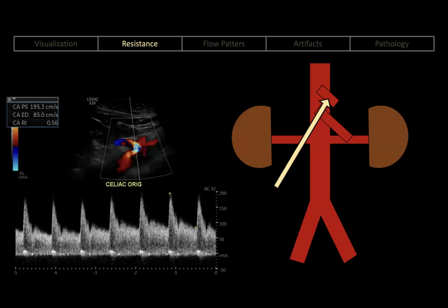Now, going up further to the celiac axis is a little bit more complex because, yes, it's feeding the spleen and the liver, which is going to be a low resistance pathway, but it also has a slightly higher resistance because there's going to be an area where you get involvement of the left gastric artery. And so there's going to be bowel perfusing that. So it's going to be a mix of some low resistance and some high resistance pathways. So it's going to be much more complex.